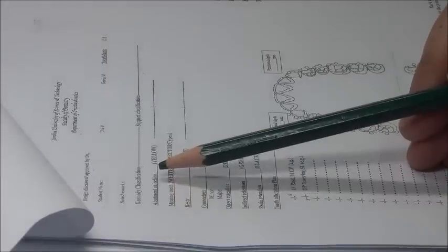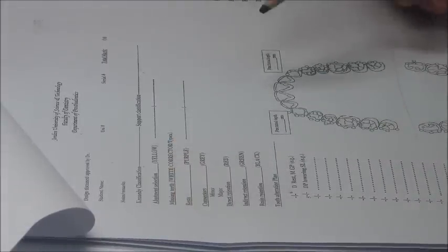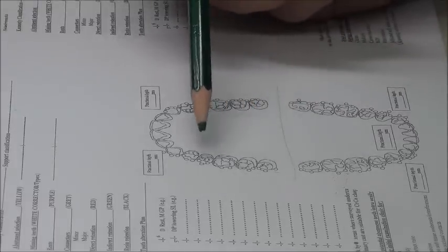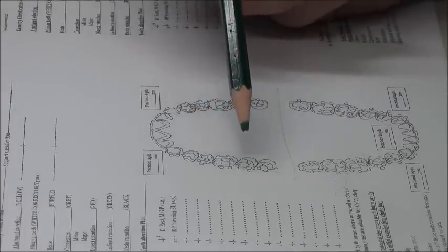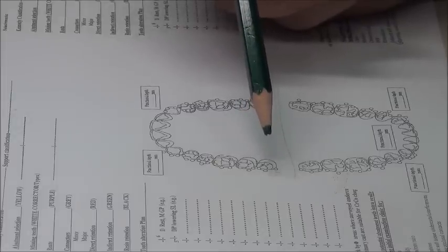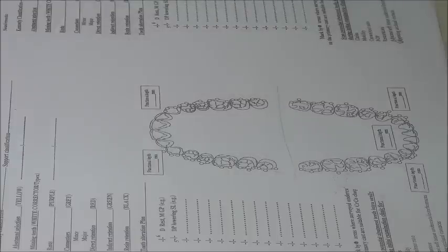The abutment selection, and this is also important. After we have removed the teeth that we don't want from our design, okay? We need to select the tooth beside our saddle and see, is it suitable to be an abutment or not? Even if the tooth is close to the saddle, it doesn't mean it's a primary abutment. So what makes us exclude the tooth from being a primary abutment? Previous pathologies in it. Maybe it has big fillings. Maybe the crown to root ratio has a problem. Maybe there are grades of mobility left from previous periodontal disease.